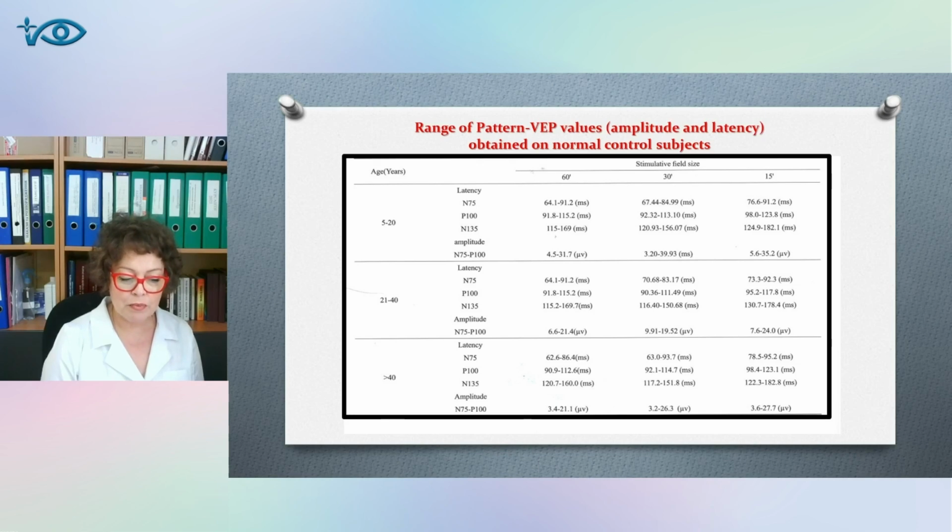Another feature of the VEP pattern analysis is the decrease in the P100 amplitude, mainly by a large square, which is the indicator of problems with the peripheral part of the visual analyzer, the eye and retina. It also indicates the partial loss of axon's function or dystrophic nature of the process in the macular region, not excluding the lesion in another part of the visual analyzer. Moreover, the P100 amplitude may decrease due to poor fixation of the gaze on the mark, astigmatism and undercorrection.